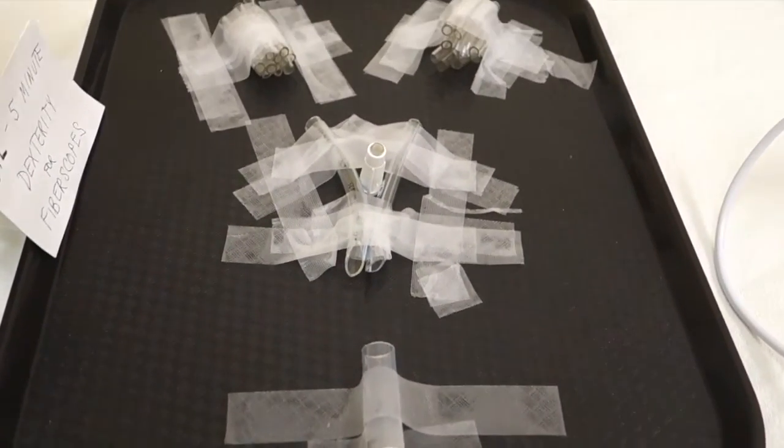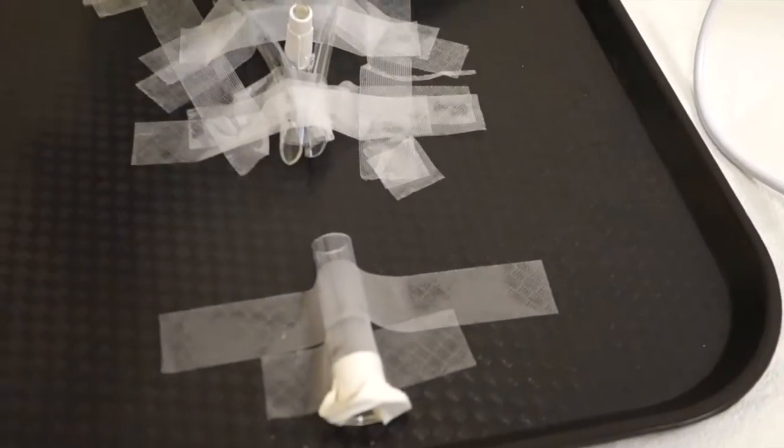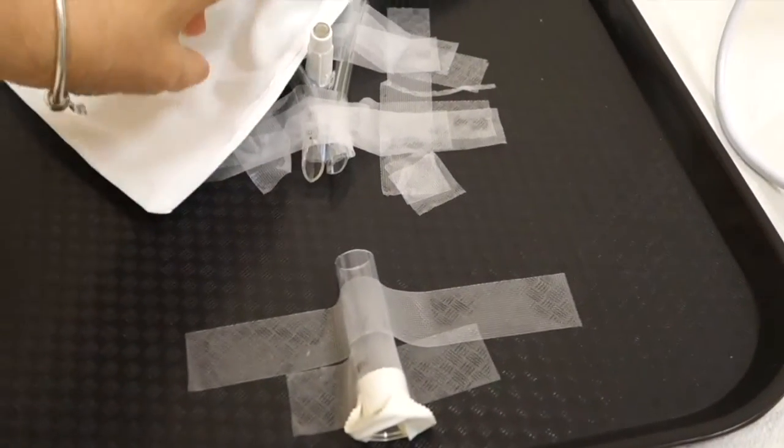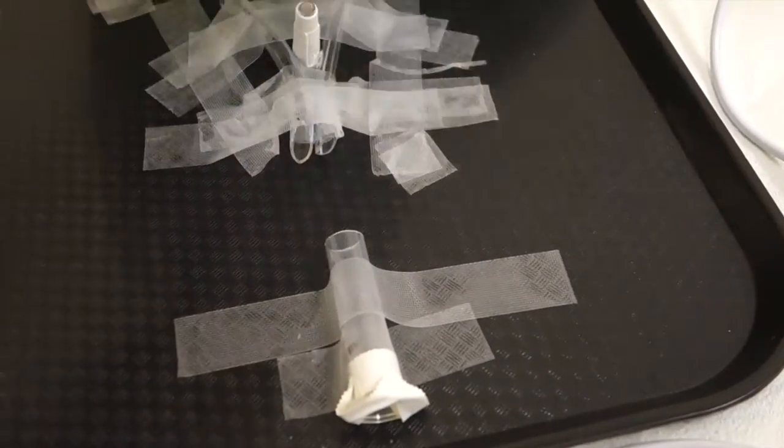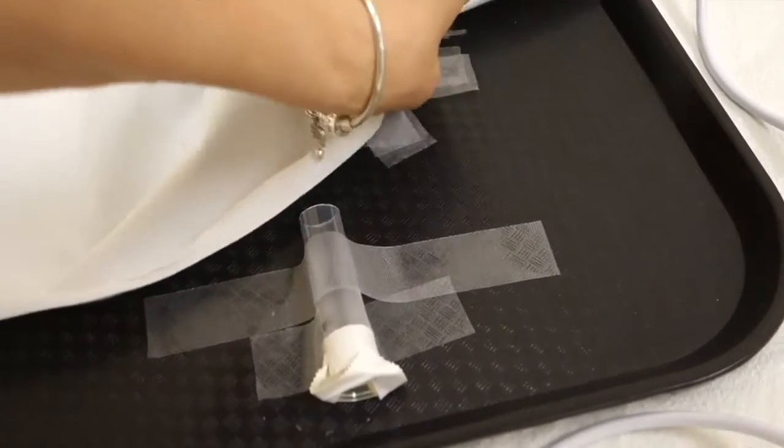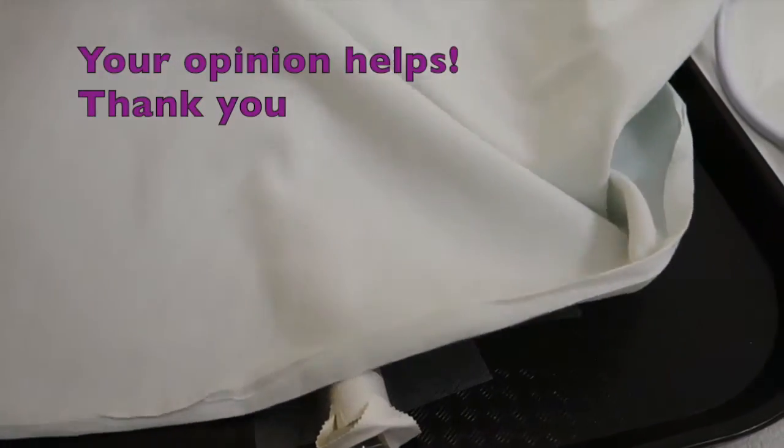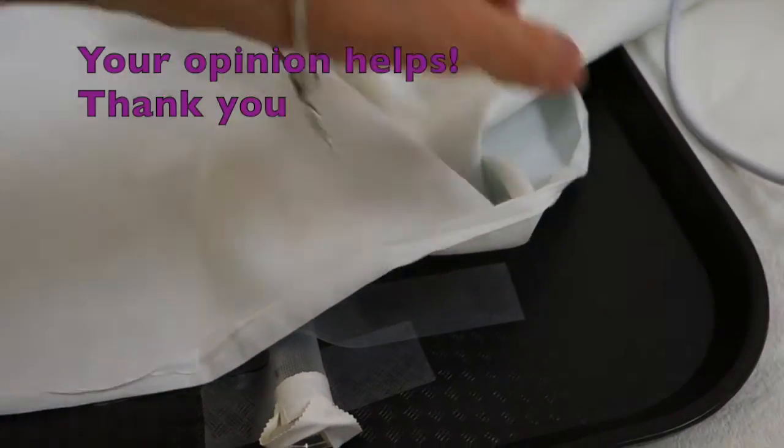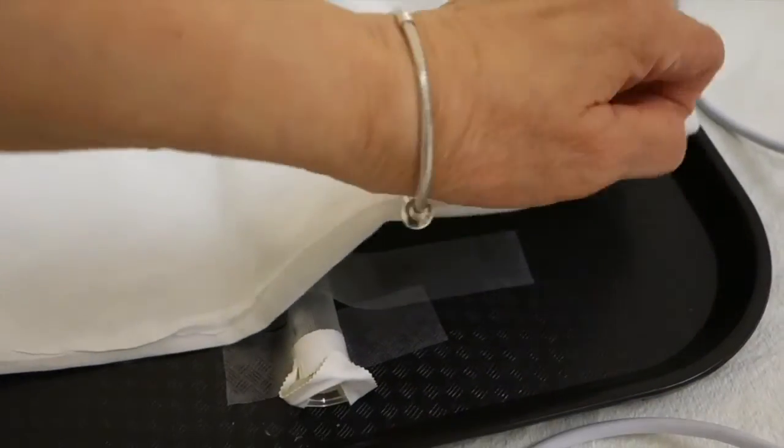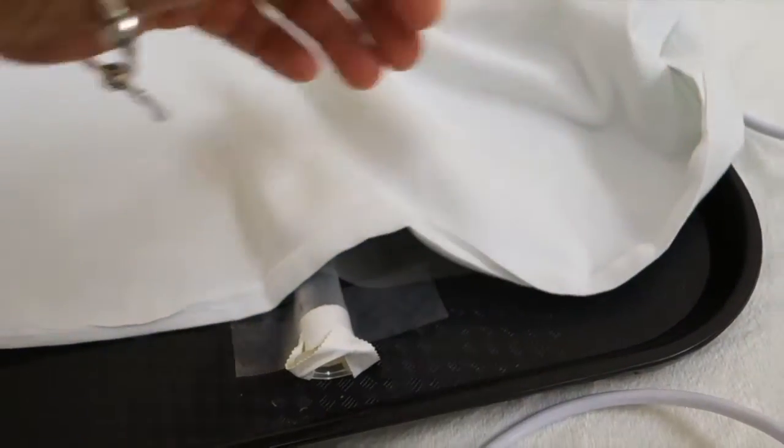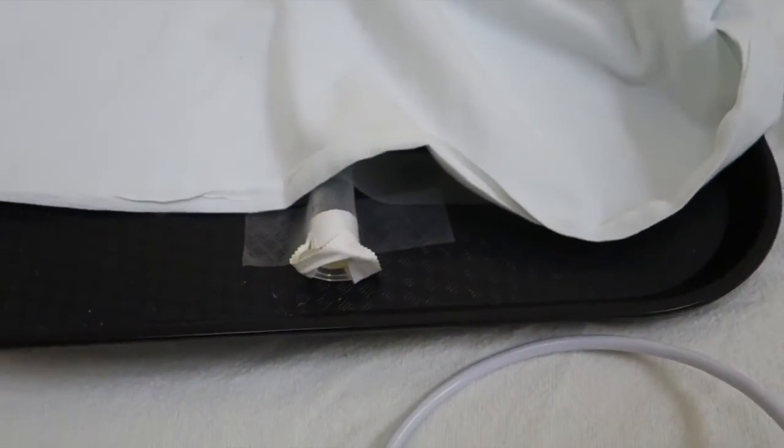That way, it'll be very similar to what you would see clinically, where you enter into a certain area, the mouth or the nose, and then everything else must be seen through the fiber optic scope.